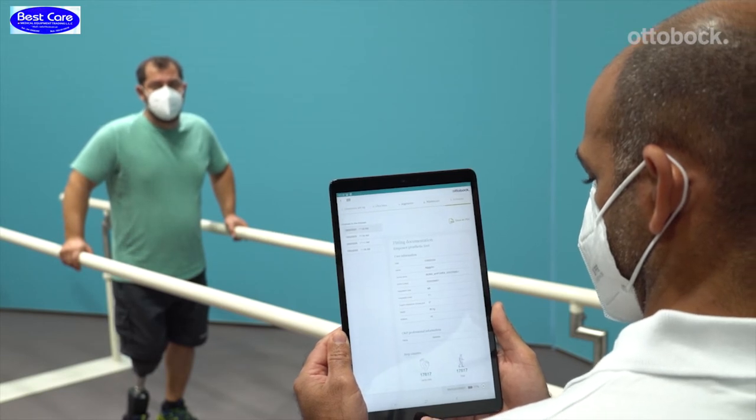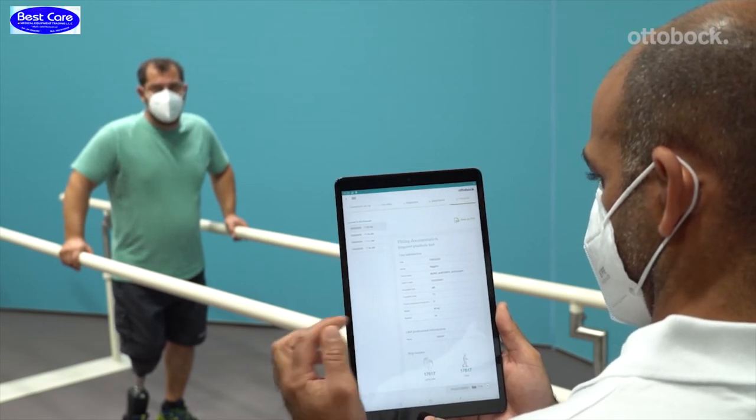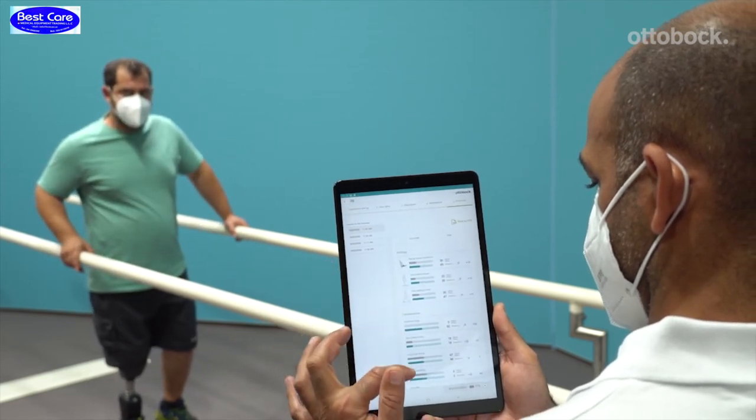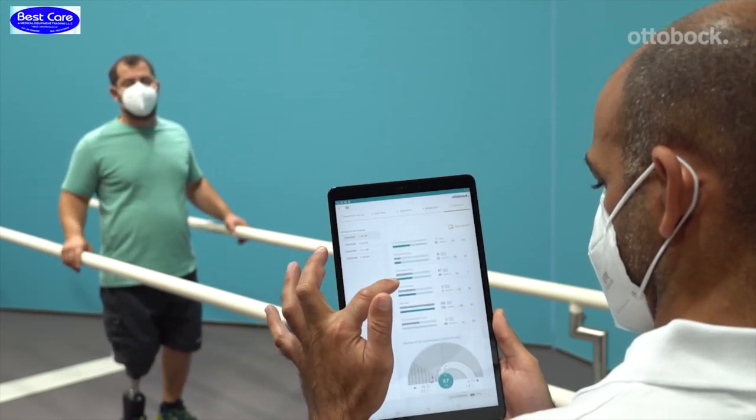In the next tab, all stored records for this foot as well as a preview of the most recent record are displayed. They can be exported as a PDF file for documentation purposes.